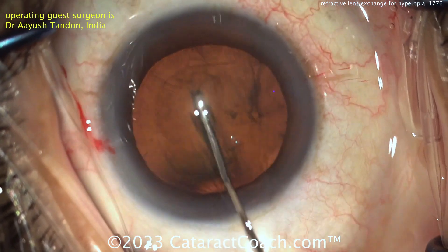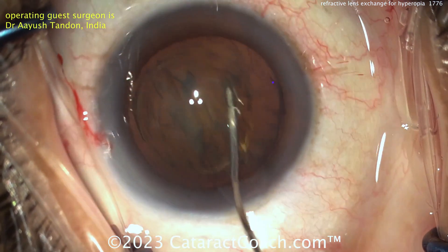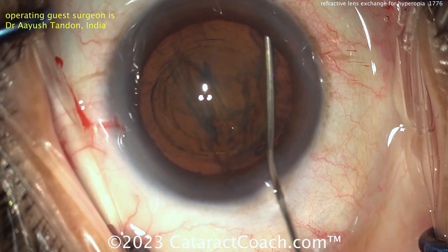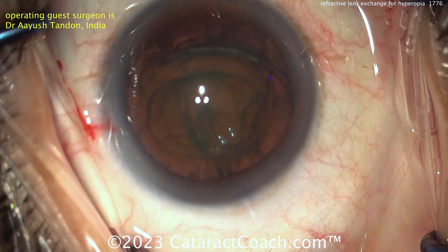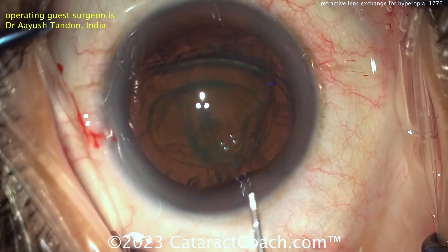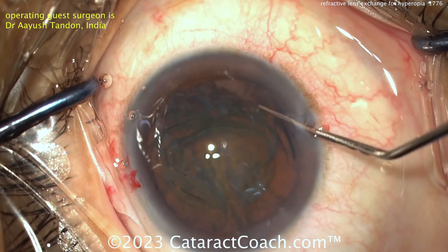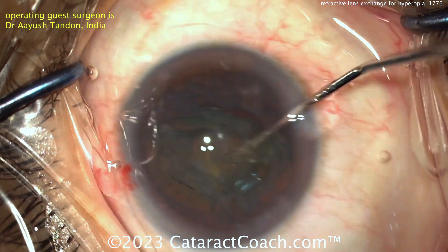I like to just get the whole nucleus out of the bag if it's relatively soft. There's a delineation as well maybe, and there it is — the nucleus coming up. I do that same technique here, like to get that nucleus up out of the capsular bag, coating the endothelium a little bit, and now the phaco probe is relatively easy to just aspirate this down.